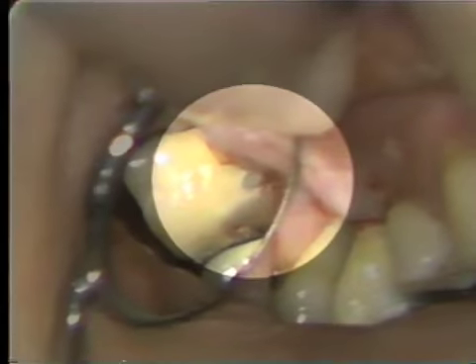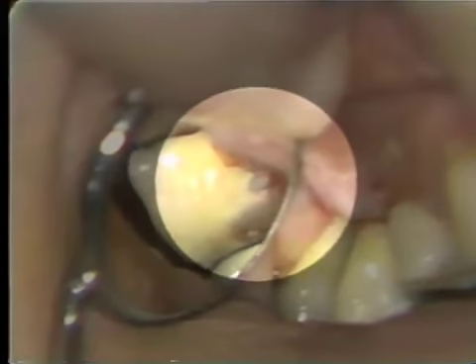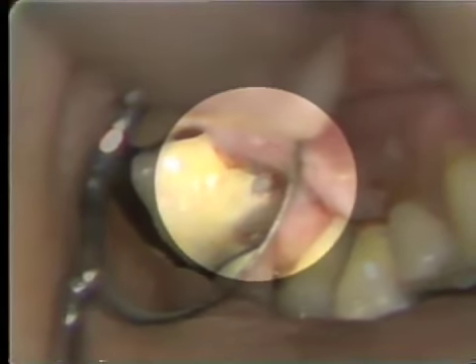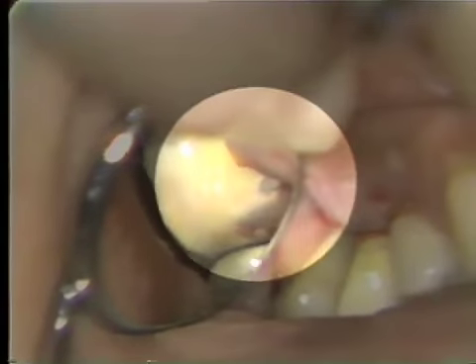The tooth has been smoothed, the root has been resected, and we can see the amalgam left in the remainder of the pulp chamber after the root has been removed. Here we see the final radiograph of the patient.